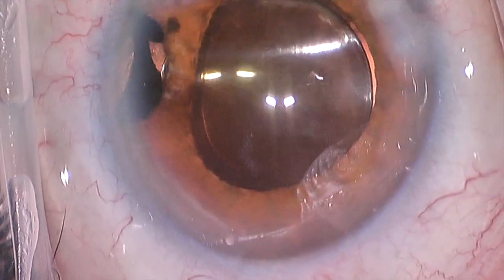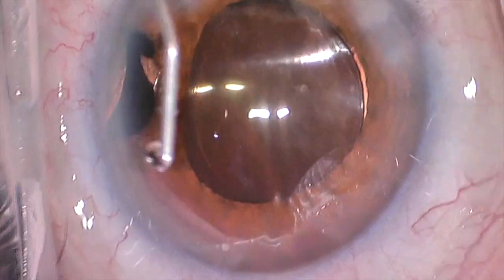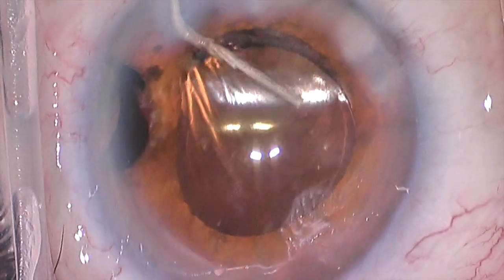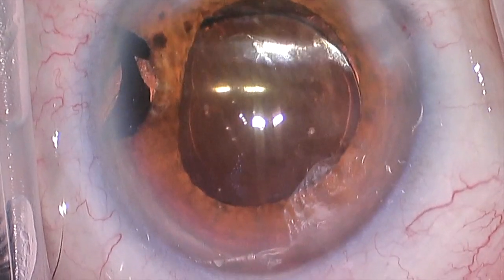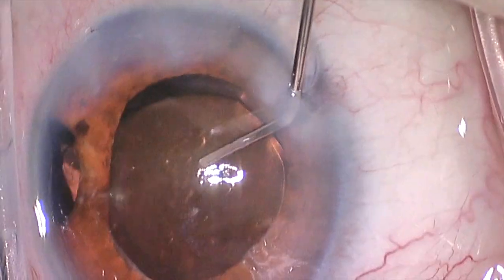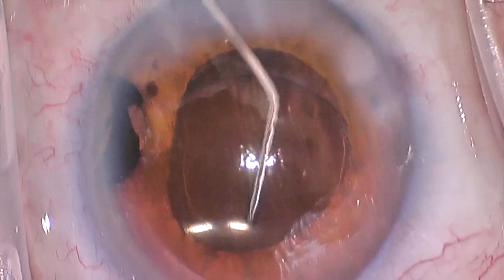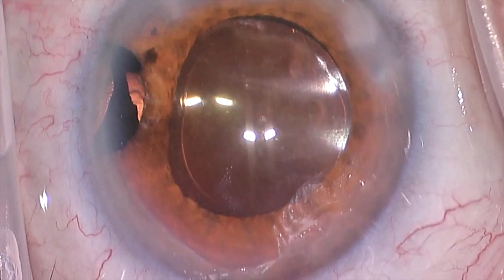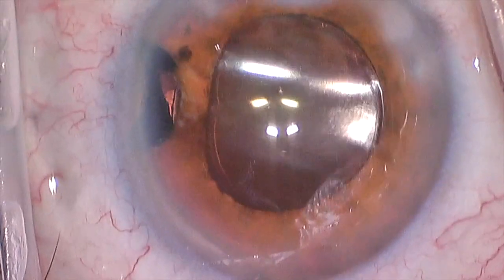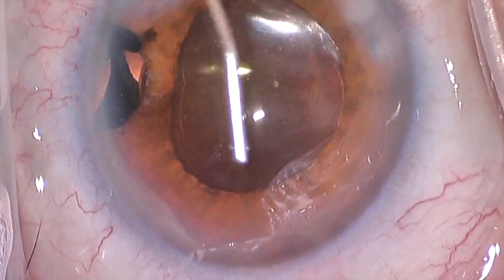Then we reinflate the eye and seal the incisions. To seal the incisions, we really just hydrate them — we put balanced saline solution in each side of the incision, which tends to hydrate them, and really there are no leaks. If there's any suggestion that the incision is going to leak, then most often we would place a stitch. It's not a big deal and does provide some security to the eye, but it oftentimes has to be removed in the future, so if we don't need to place a suture, we don't. I place some antibiotic inside the eye, do one final hydration and check of the incisions, and we're done.